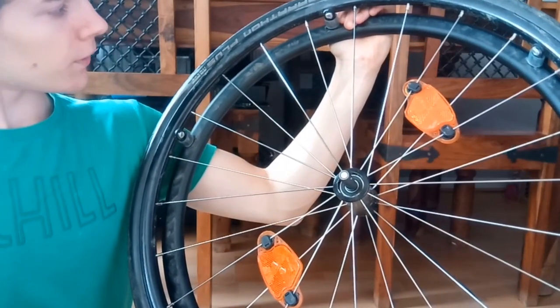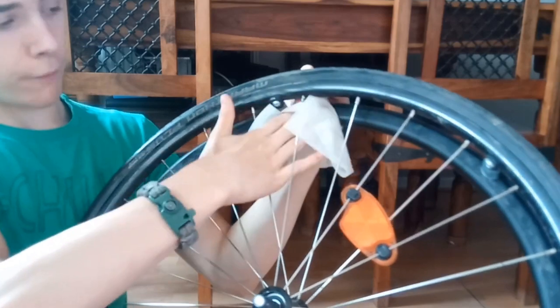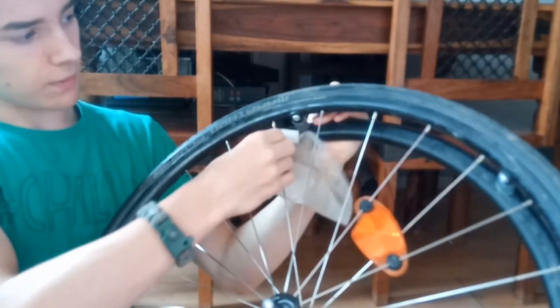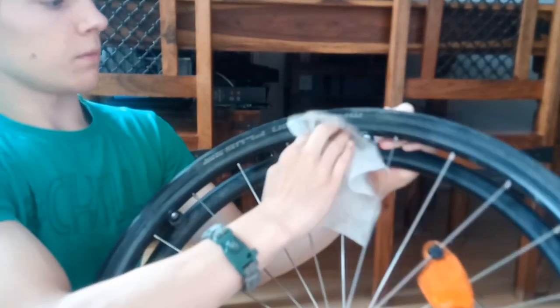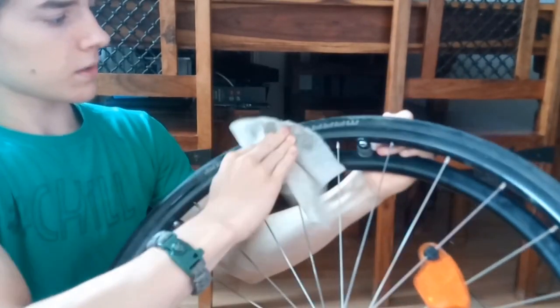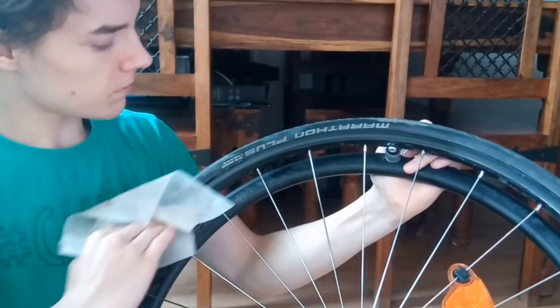Also, kind of forgot about the insides. Don't forget about them, these do need cleaning. You can see where I can put my fingers, if it's even in camera. But, yeah, I'm just going to do this for the next couple of minutes, and I'll get back to you when I'm done. Okay, so got a bit of a mess here.